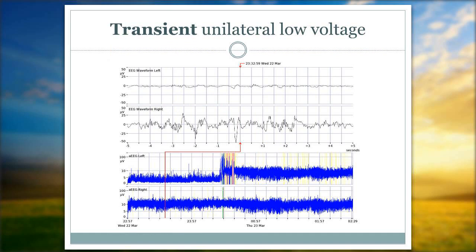When you only have one channel and you're pulling EEG data from the left side of the brain and the right side of the brain and combining them together, the good, healthy side of the brain can generate enough electrical activity that it eclipses the fact that the one side is not offering very much electrical activity at all. So in the old days of aEEG monitoring, these babies went unidentified as having any abnormality, and their aEEG was classified as normal. Then when they would MRI these babies later, they would find that some of these infants had unilateral strokes or unilateral injuries. So the advantage of putting on extra electrodes is that you now get the chance to compare the right and the left.